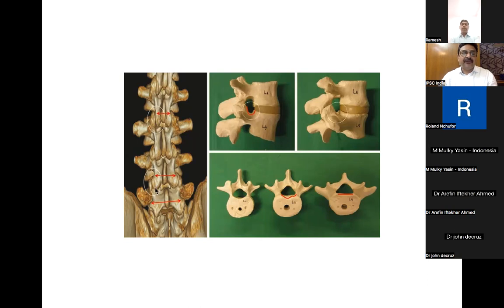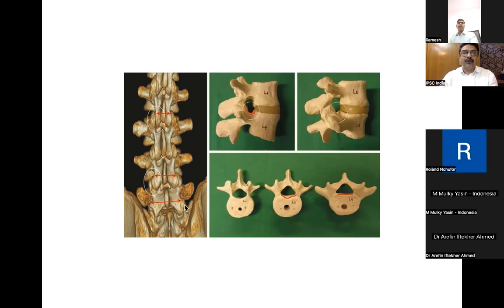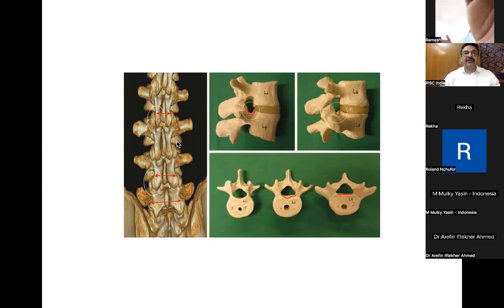If you look at this anatomy, I'll briefly cover it once again. See where the facets are lying at the L5 S1 area. As we go upwards, look at this. The facets are more horizontal here at the L5 S1 level. As we go upwards, the lamina is shorter, and look at the interpedicular distance over here. So what may be true for L5 S1 is not true for L2, L3 or L3, L4. The angulation and the distance from the midline will change from level to level.